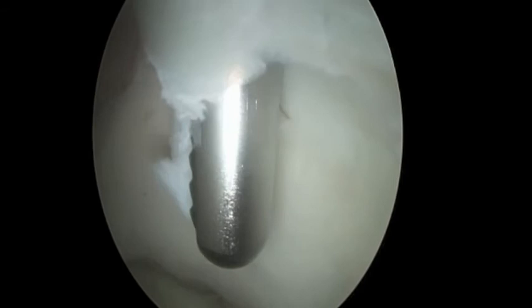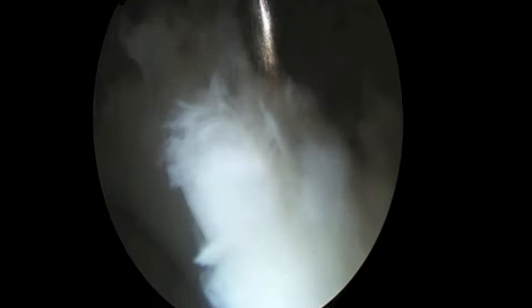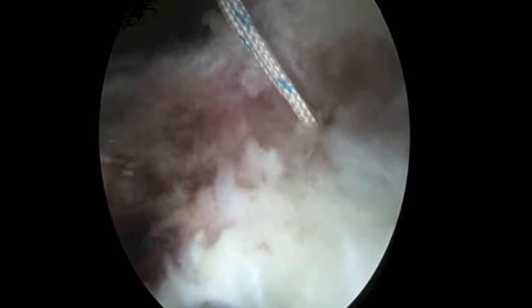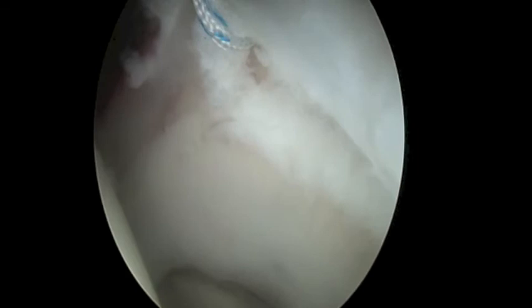After that loose cartilage was completely removed, we probed the labrum further. Here you can see us identifying the complete separation of the labrum. We then proceeded with a repair of the labrum by placing suture anchors in the superior acetabulum. Here you see a suture anchor entering the bone, and ultimately sutures were passed around the labrum. Two sutures were used in this instance.